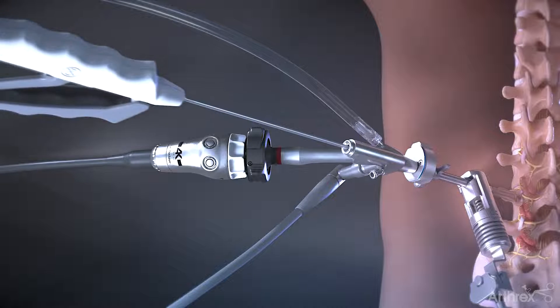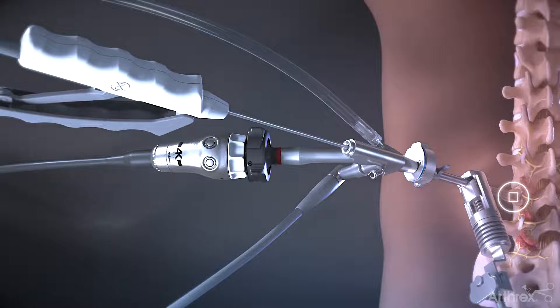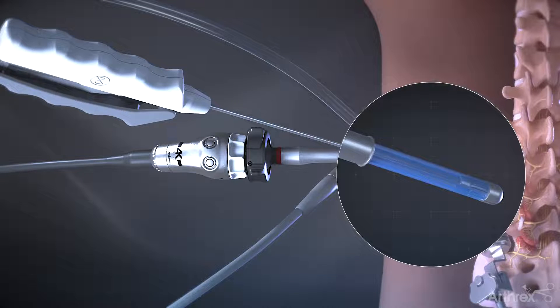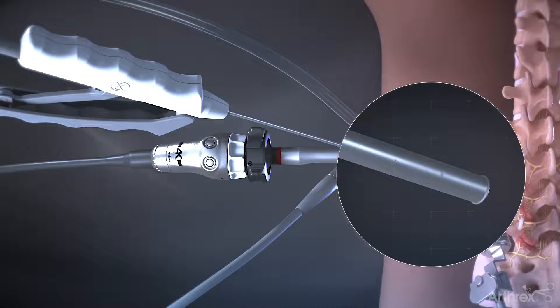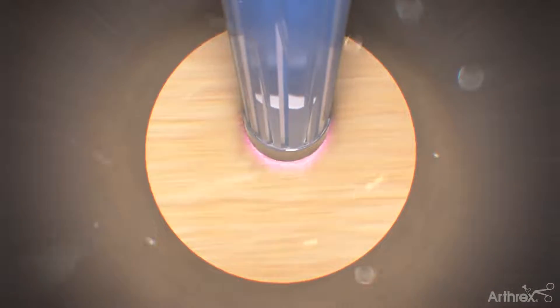A series of endoscopic tools, including an electrosurgical probe, graspers, and others, are inserted through the working channel of the endoscope to remove excess tissue and coagulate blood vessels.